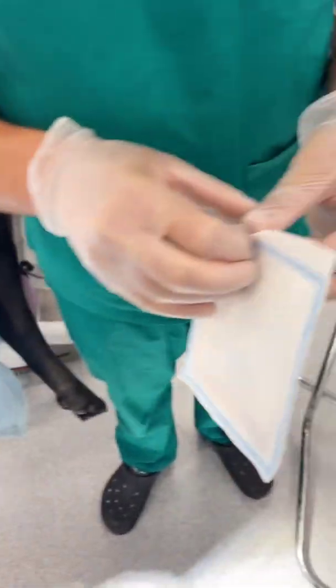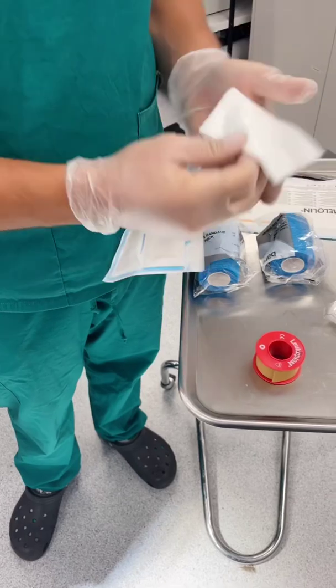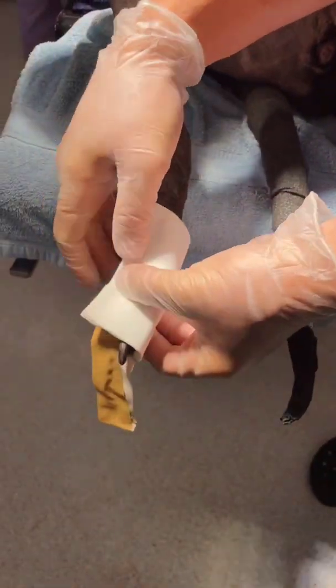The next thing I'm gonna do is put our contact layer on, which is gonna be this Melolin pad here. That's just gonna sit straight over the top like that.